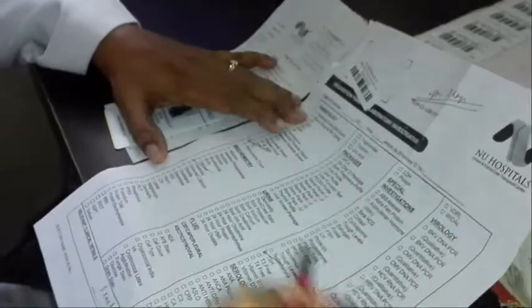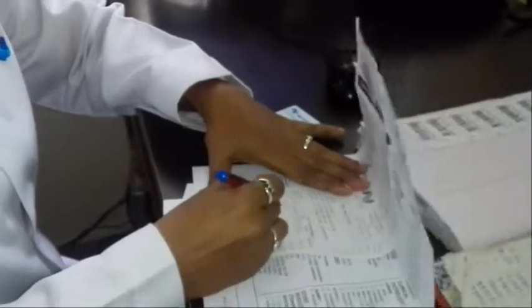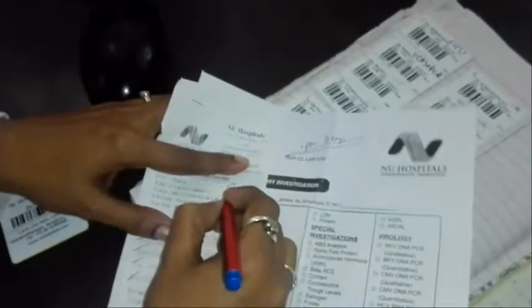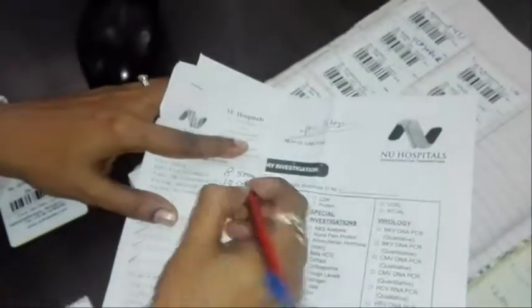The staff asks the patient whether he or she is on a proper diet and marks the necessary fields. It is again cross-checked with the receipt and the detail sheet. The staff will note down the time at which the sample was taken and the time the report will be ready.